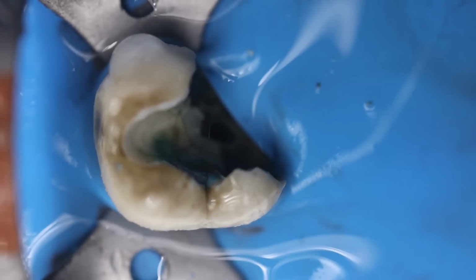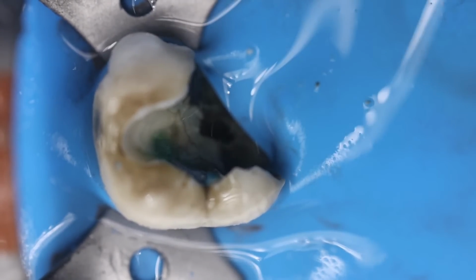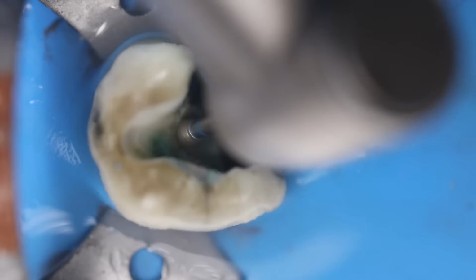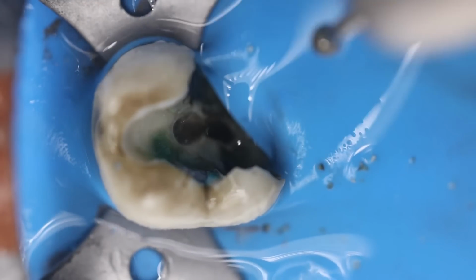Now you can visualize that we are deep inside and we are on the roof of this pulp chamber. So we are just waiting for the bird drop. Now we can just approach in the center. See, this is the bur drop that we get.